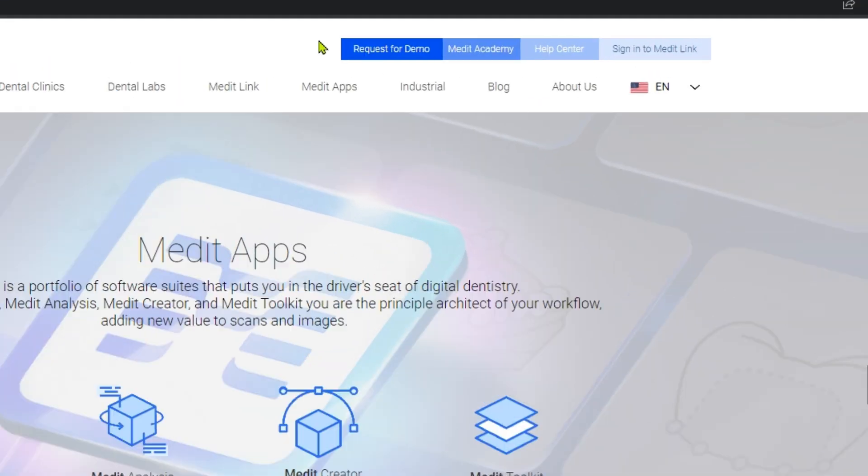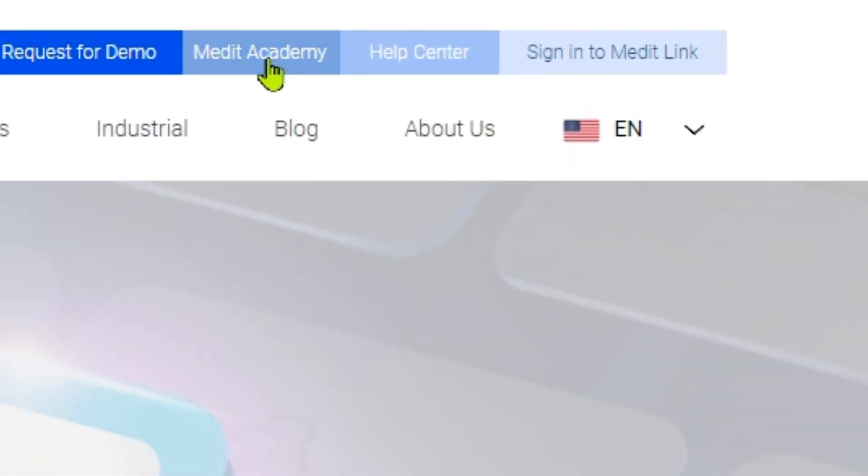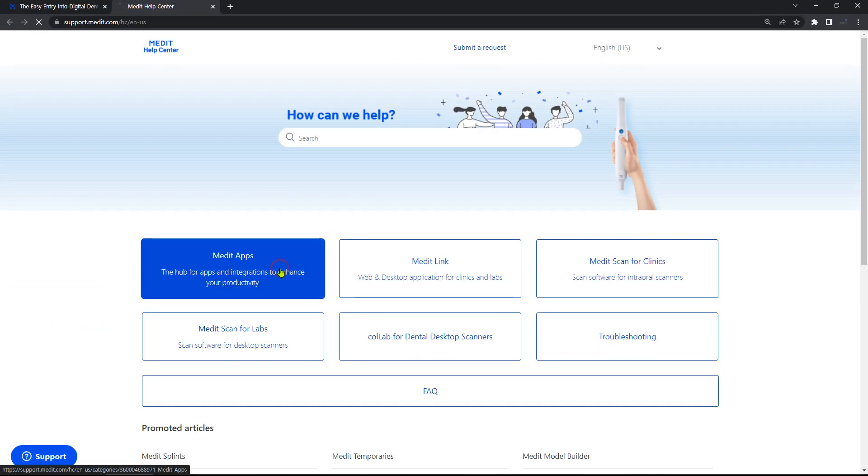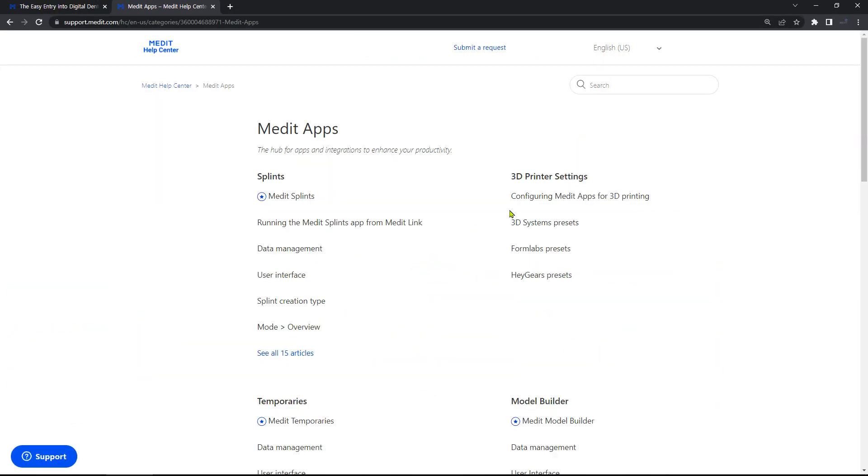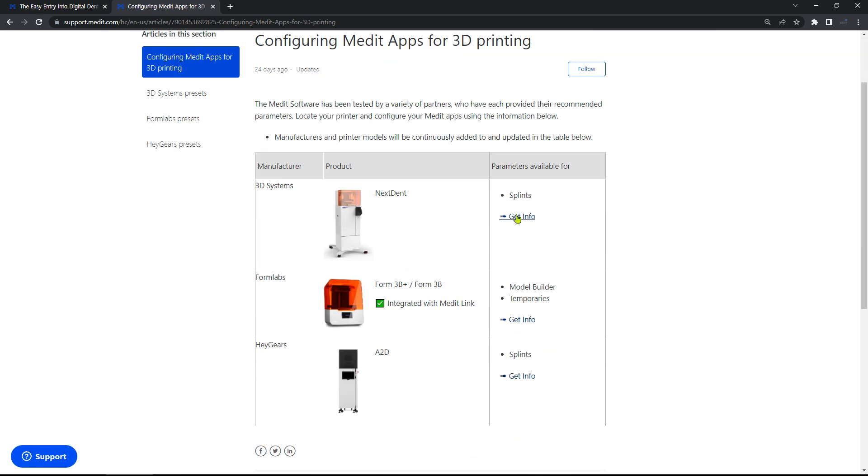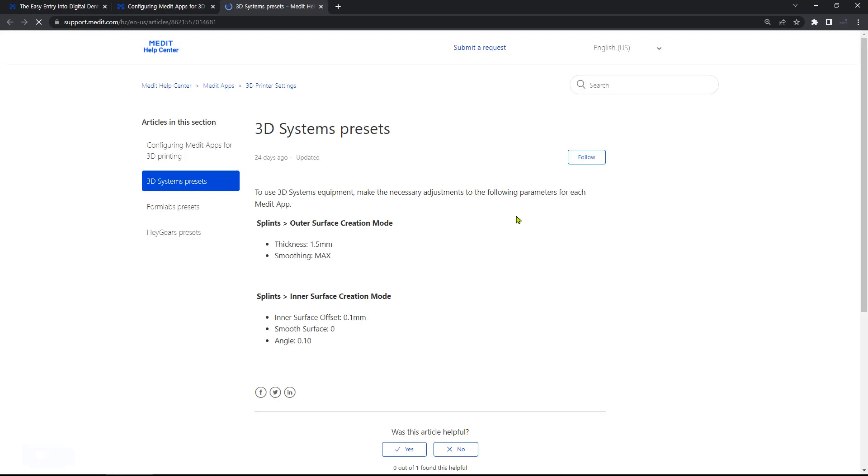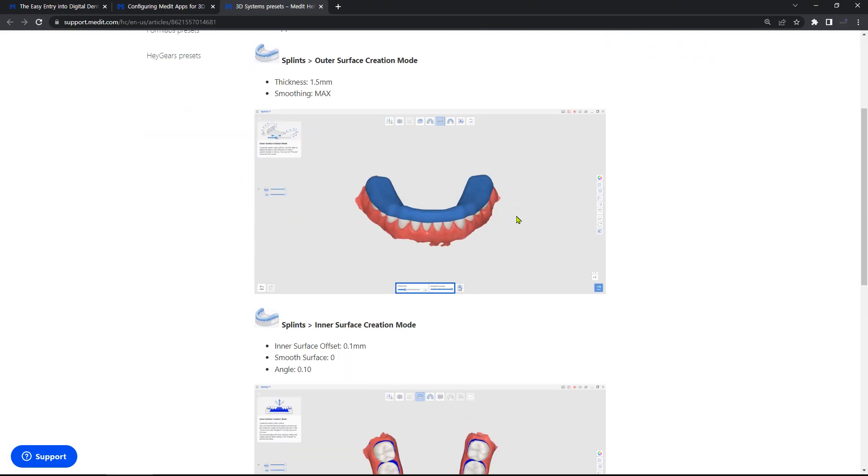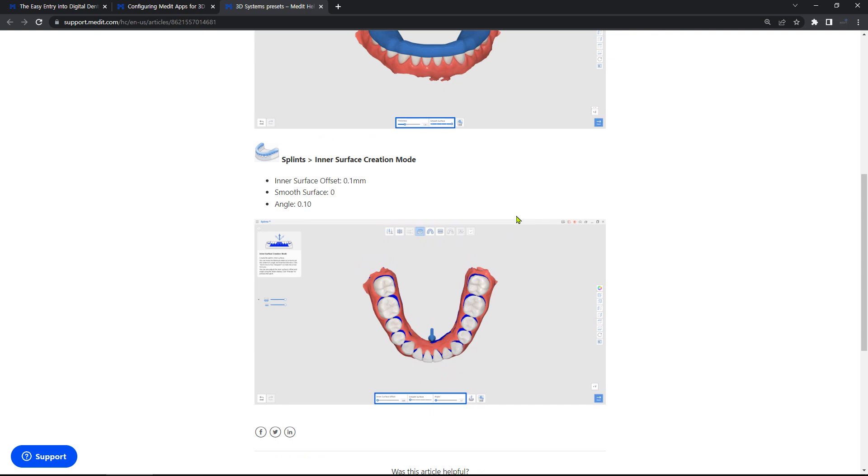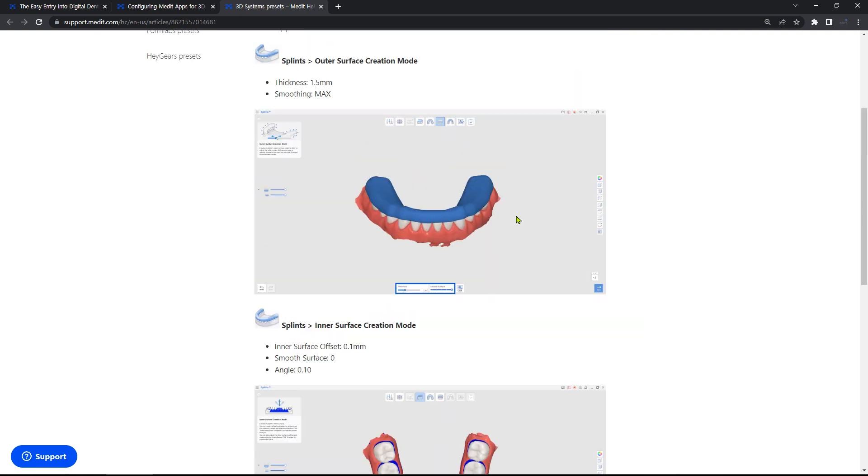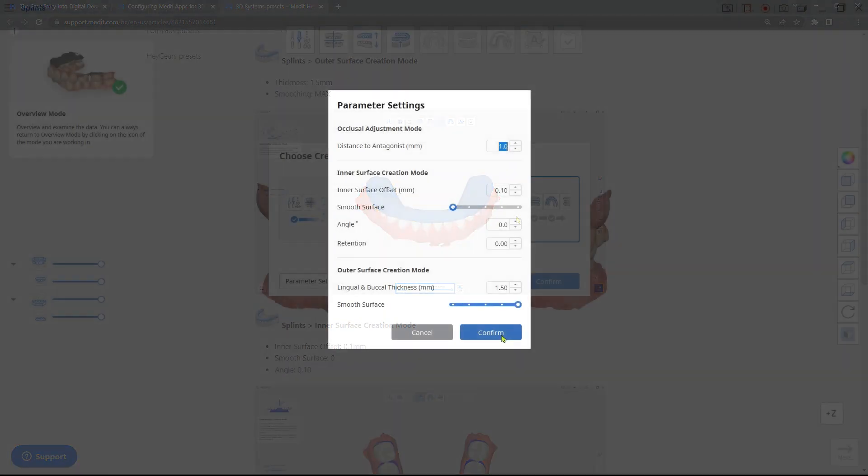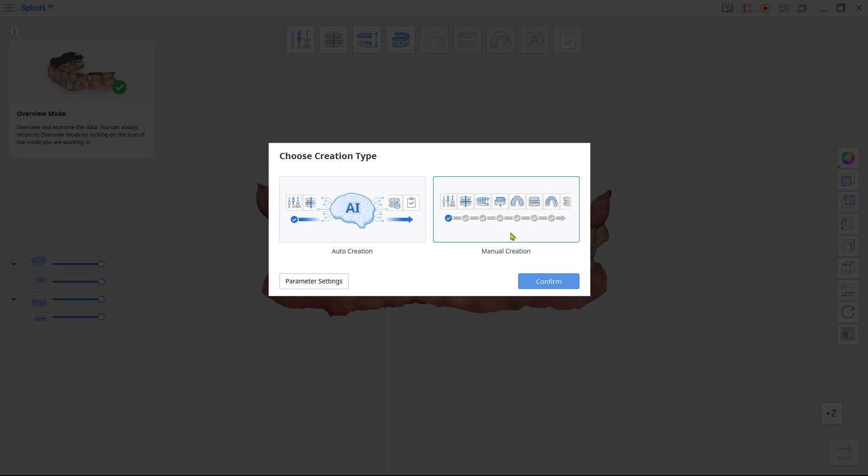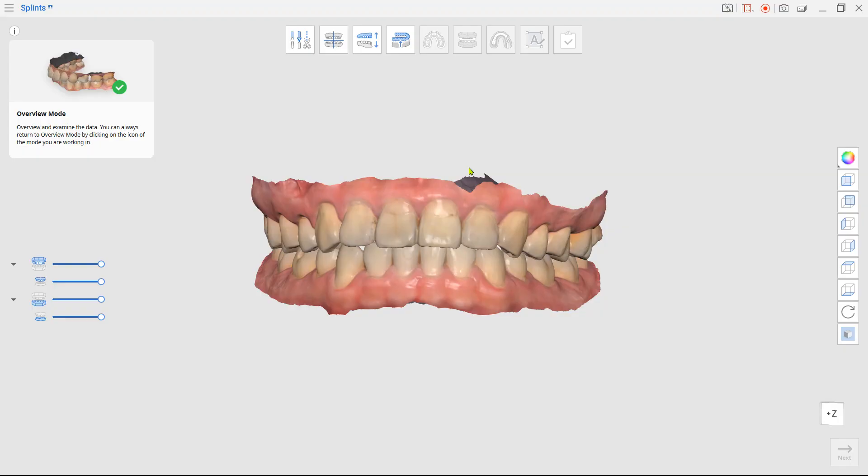In our help center, you will find the recommended presets from the 3D printer manufacturers who have tested their product with our apps. Next, choose manual creation to complete the creation process step-by-step.